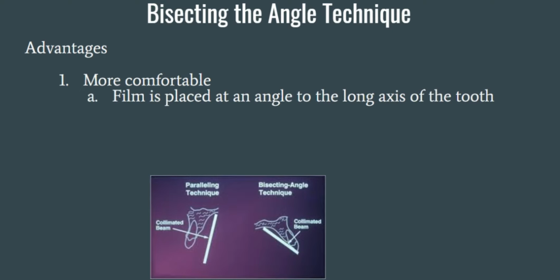Also, the film is going to be placed at an angle to the long axis of the tooth, so it just sits more comfortably in the mouth altogether. Therefore, it's a little bit less likely to pinch the tissues.